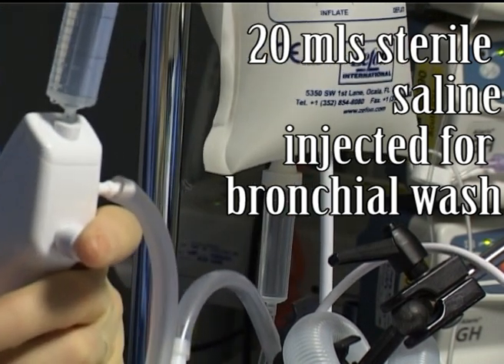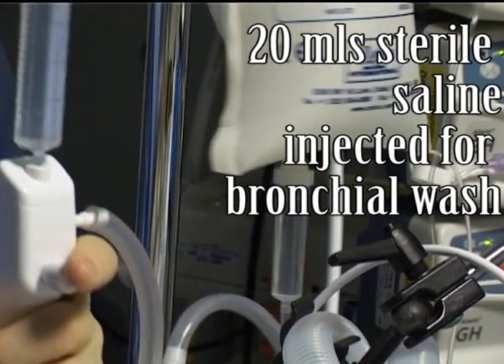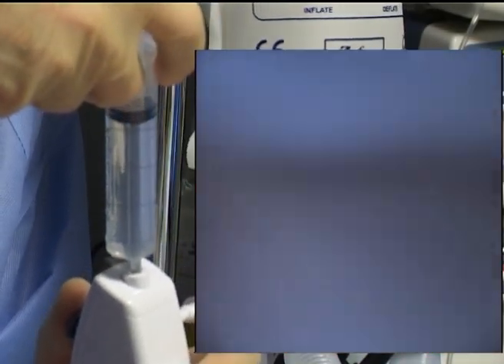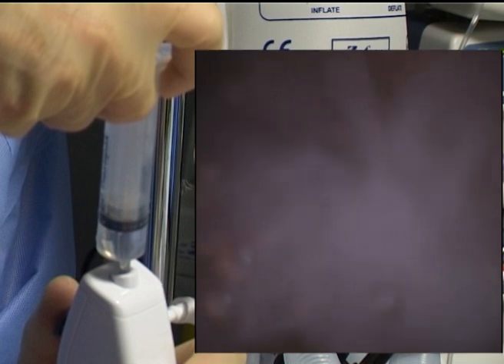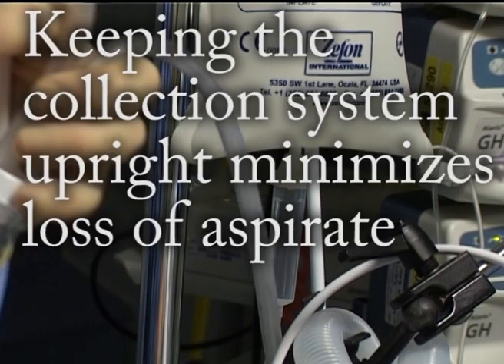A suction system has been connected to the bronchoscope. This incorporates a sputum trap for capturing any aspirated material. As we start to inject, you can see on the endoscopic view that the mucus plug is dislodged. The saline is left in situ for a few seconds and then the mucus plug and some of the saline is aspirated.